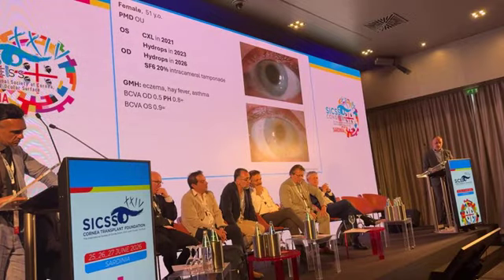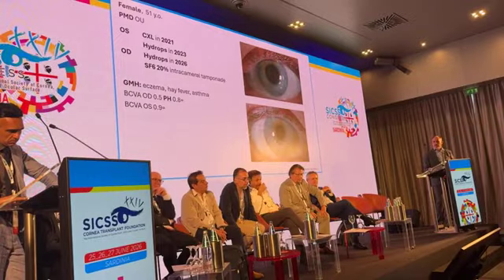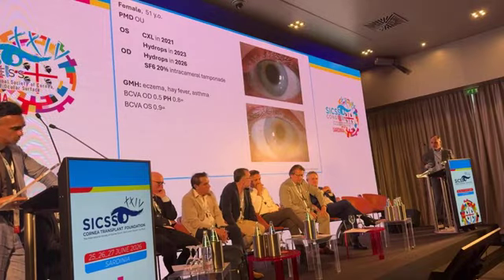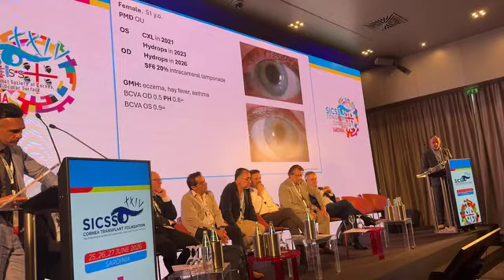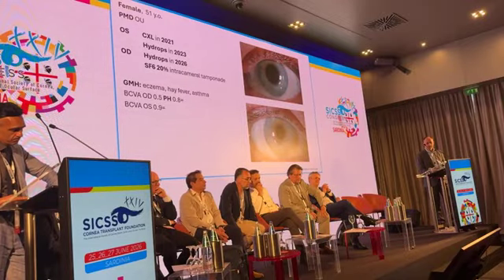I put in the right eye SF6 20% intracameral gas tamponade. You still see the bubble on the right eye because this was taken a week after. It helped to reduce the edema considerably. And I chose not to put sutures, considering what the follow-up therapy would be. She has eczema, hay fever, and asthma, so the full inflammatory package. Her vision with glass correction is actually quite good. The right eye is 0.5, 0.8 minus with pinhole, and the left eye 0.9 minus.